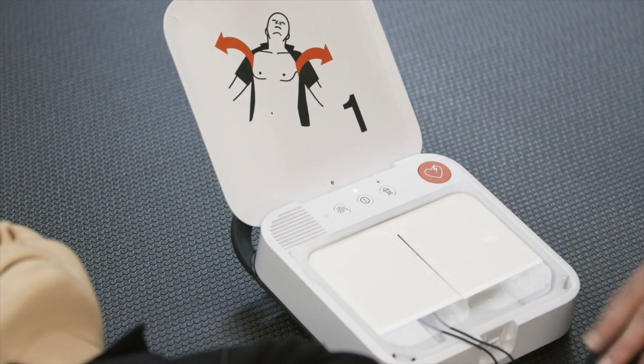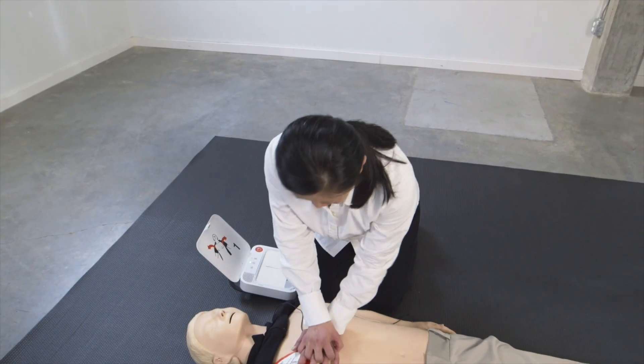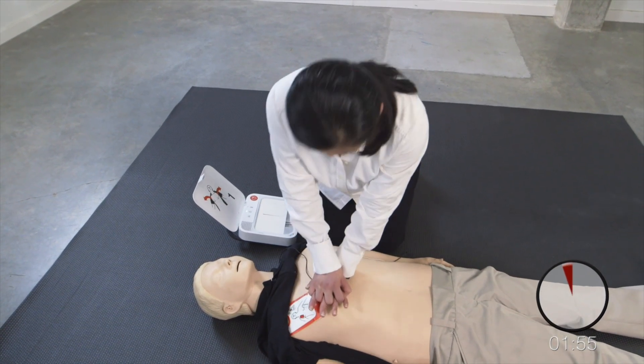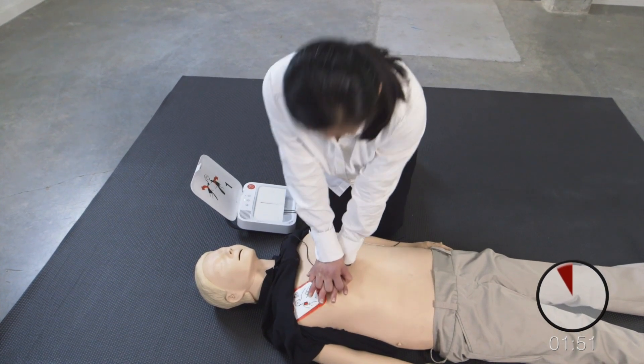Press flashing button. Shock delivered. Provide chest compressions to the beat. The heel of one hand should be in center of chest. The other hand should be on top of first hand. Push down hard at least two inches.